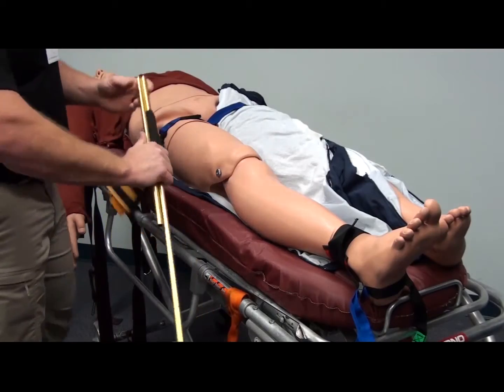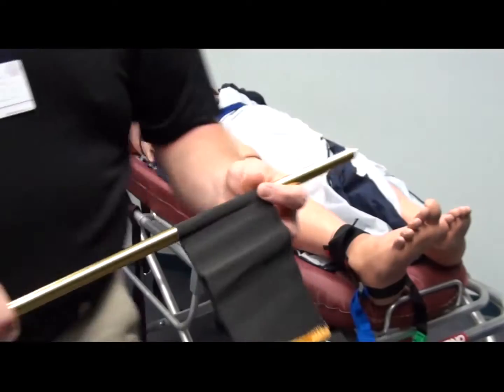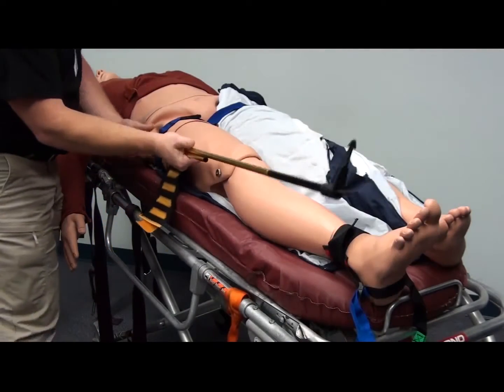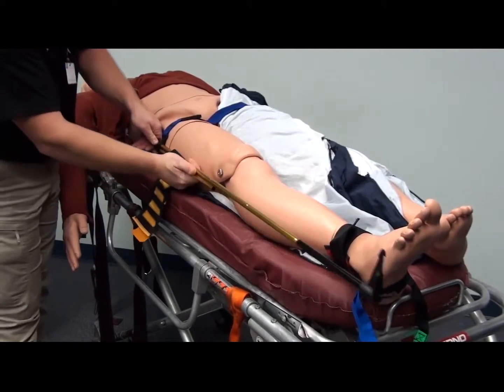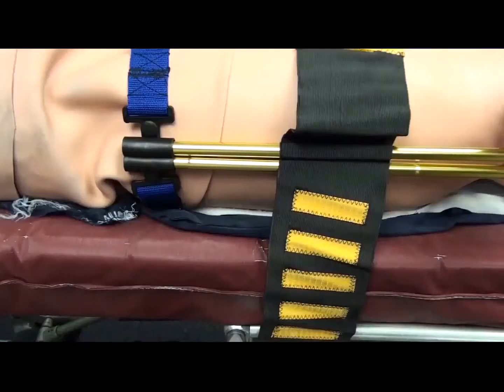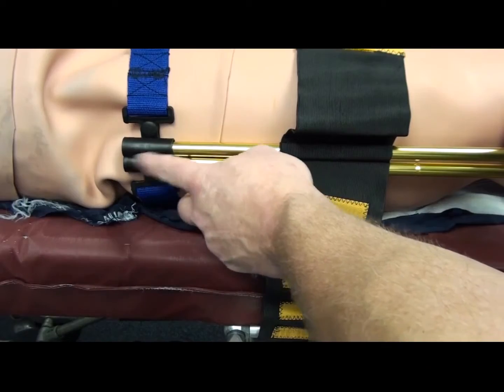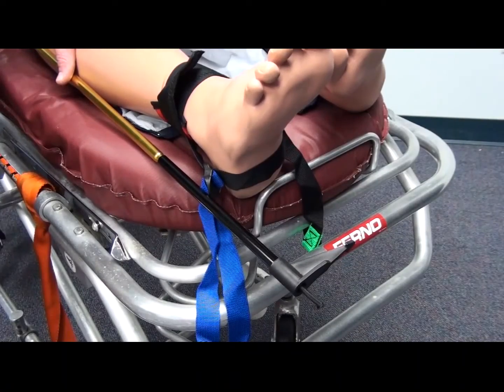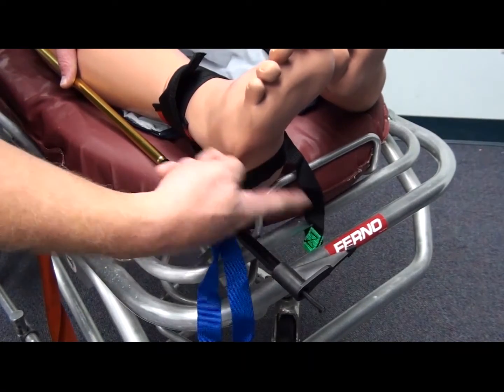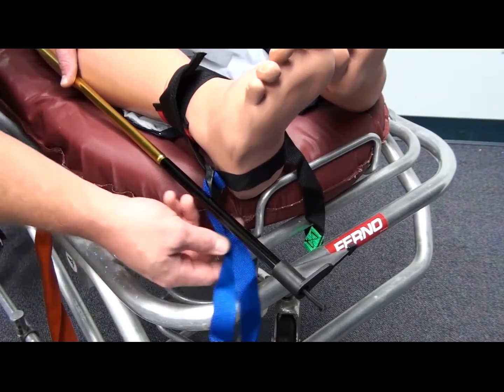So they fold, it pulls out, simply pulls out, folds back over one another, and now we're going to place it into the pole connector. Okay? Once it's connected, that is what it's supposed to look like. These poles pushed up into the connector and secured very firmly. So the pole on this side should be 3-4 inches below the ankle at this point.